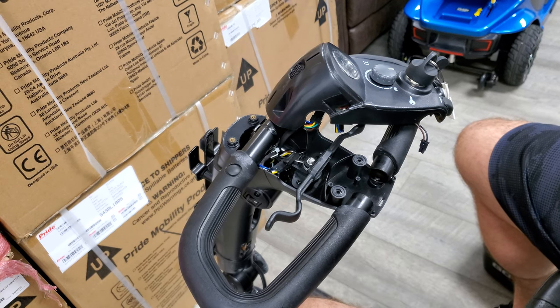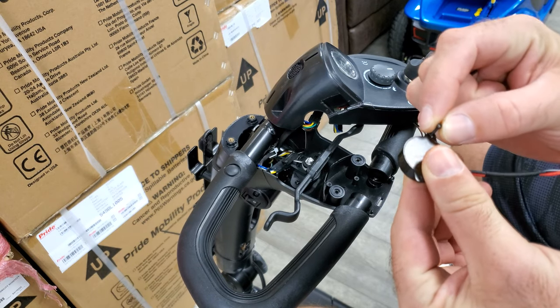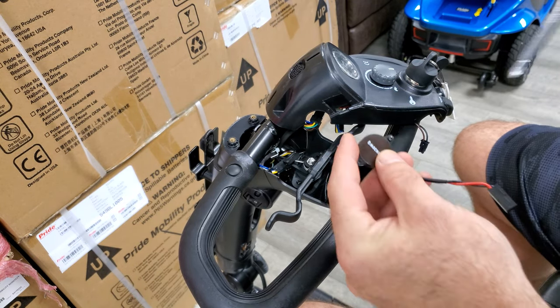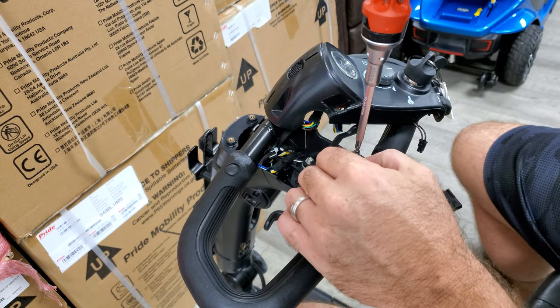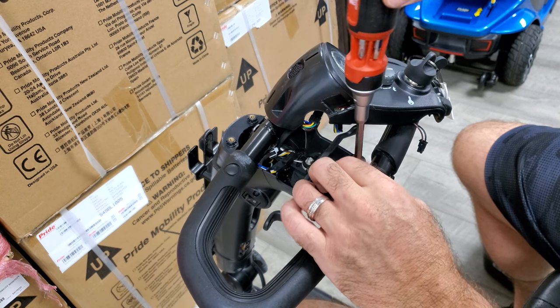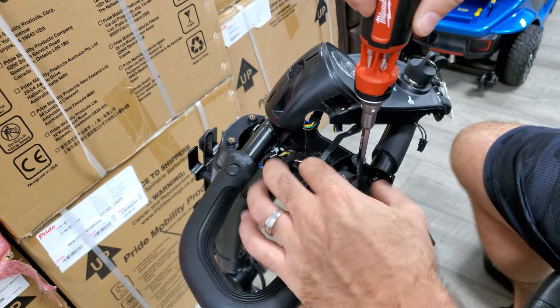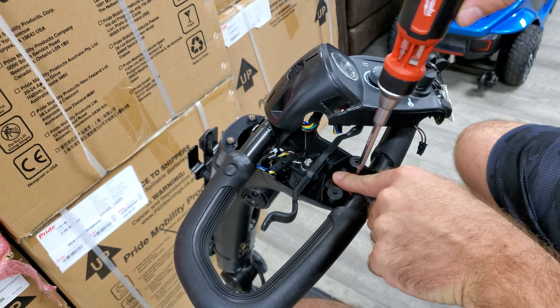We're going to go ahead and replace it, putting the existing screws back in. Put that in place and then get that one set up too.